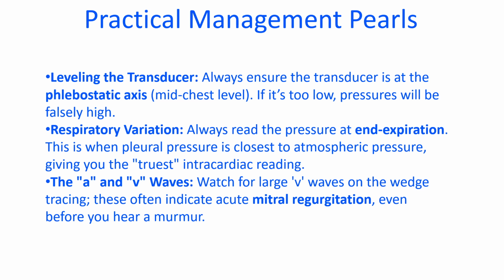Here are some very important practical tips. Leveling the transducer. Always ensure the transducer is at the phlebostatic axis, that is the mid-chest level. If it's too low, pressures will be falsely high. Respiratory variation. Always read the pressure at end expiration. This is when the pleural pressure is closest to atmospheric pressure, giving you the most true intracardiac reading.